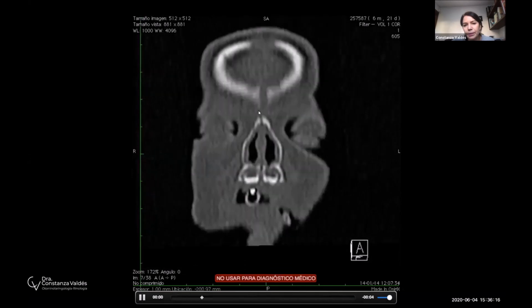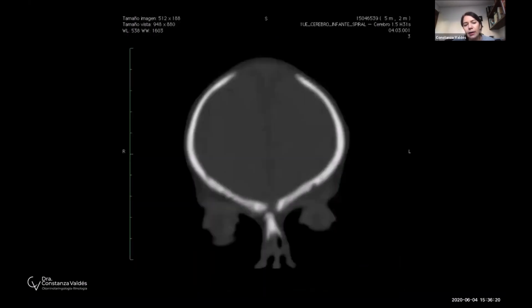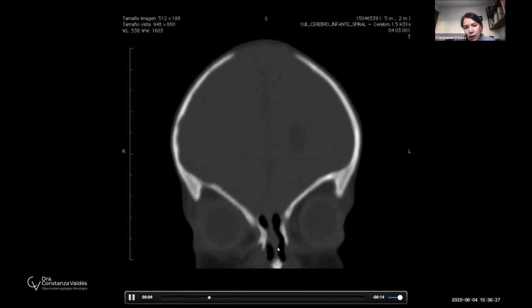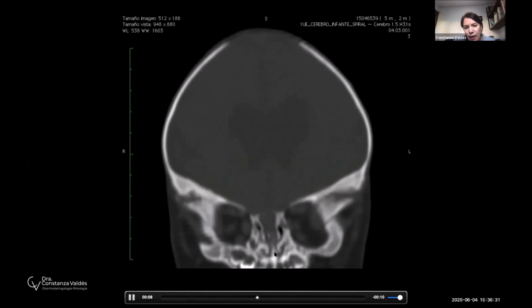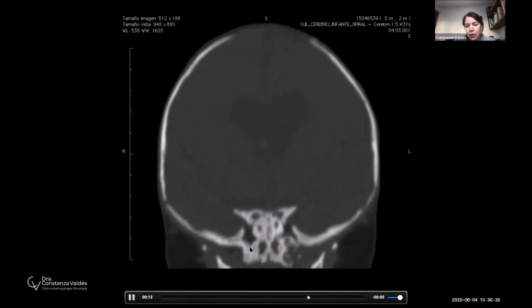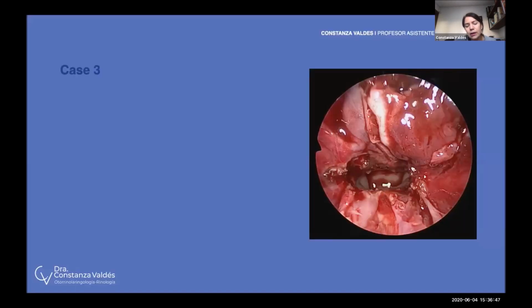No, the skull base is not that low. And this other patient is the patient I'm talking to you about, the syndromic, this very narrow nose. And you can see that the skull base is coming very down, and look, posteriorly, a very, very small nose. So usually patients that have, and here's the comparative, you can see a very narrow nose, the skull base is more inferiorly.